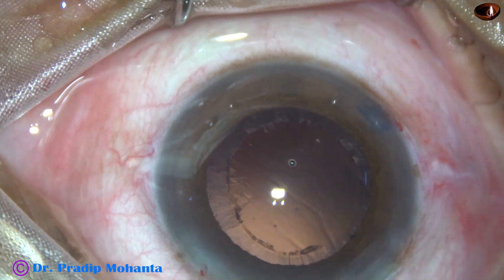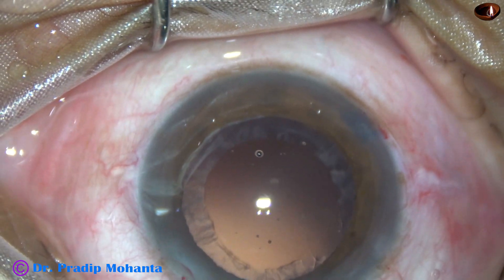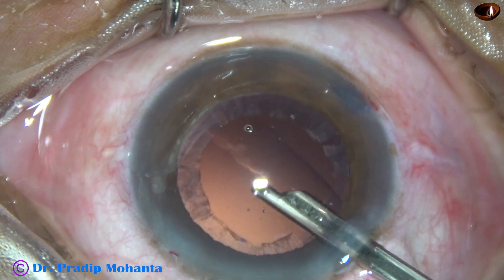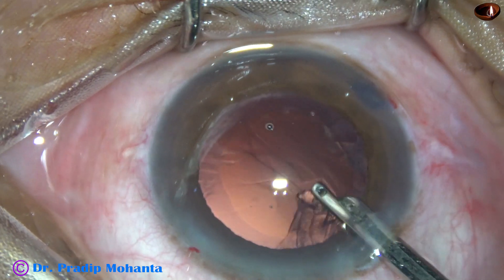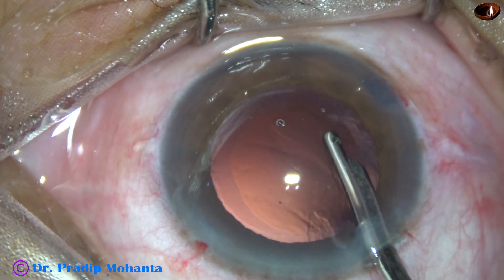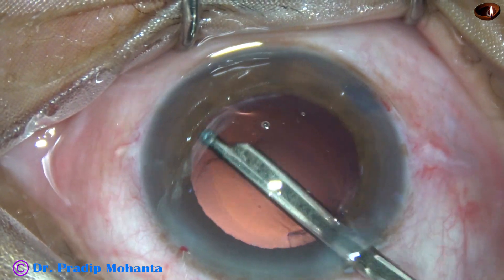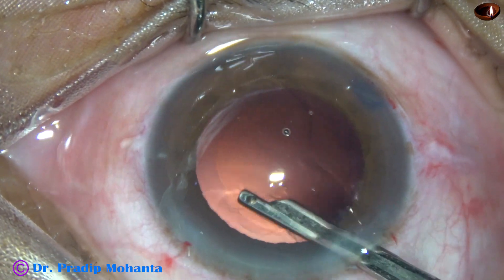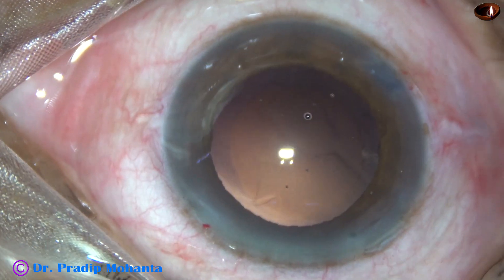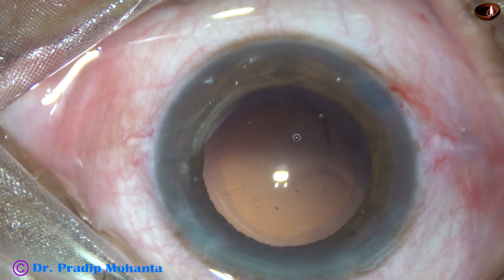Now very little cortical lens matter is remaining. In this case I have used a 23G direct Simcoe cannula to remove the cortical lens matter. See how easily the cortex can be removed with a very slender 23G Simcoe cannula. The sub-incisional cortex is removed going through the right side port, and a speck of cortex remaining at around 9 o'clock is removed going through the left side port. Cortical clean-up is complete.